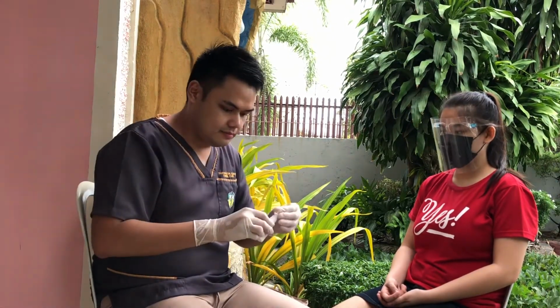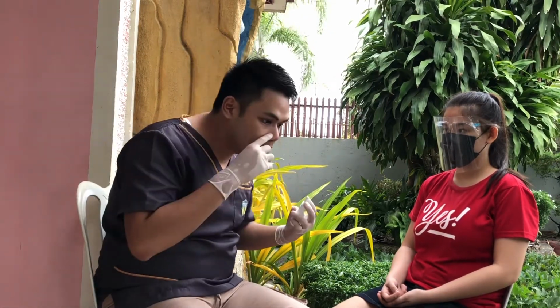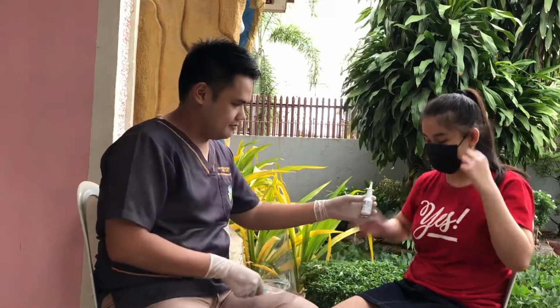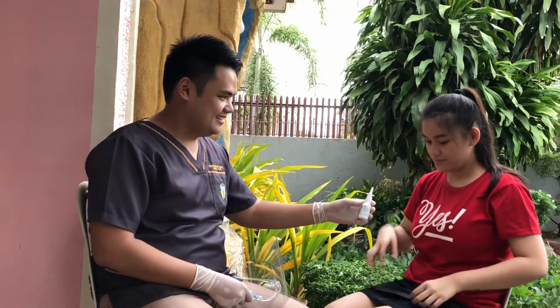When using the nasal spray, instruct the patient to tilt their head forward and pinch the nostril that will not be sprayed. Upon the administration of the spray, ask the patient to do a sharp inhale accompanied by the squeeze of the bottle.